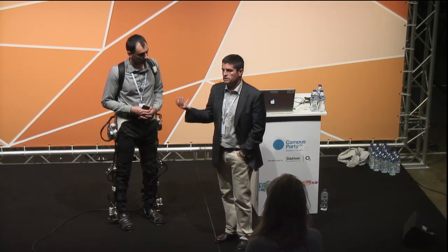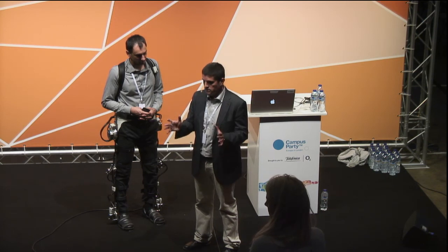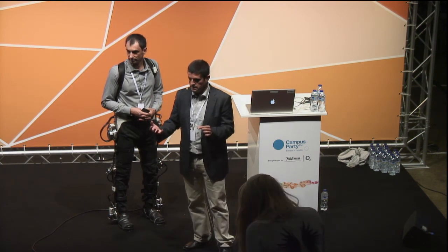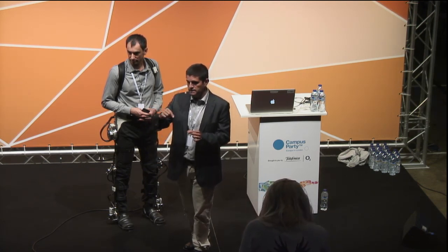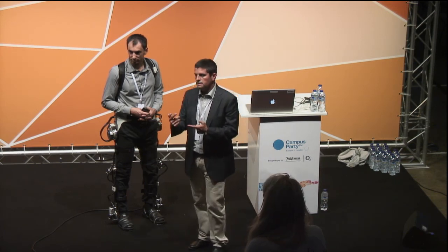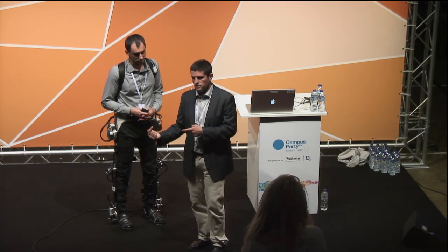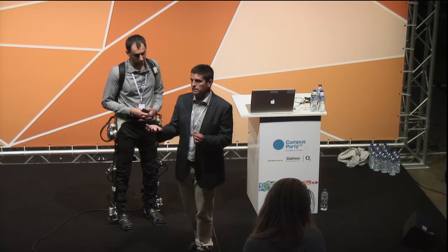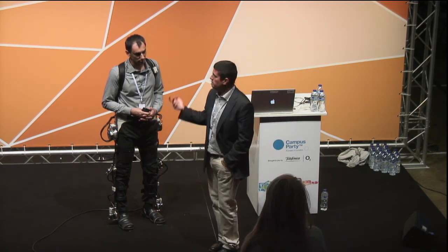Then we have several ways of controlling the system. One of the ways is what we call assist-as-needed. In this particular strategy, what we have is an ideal gait pattern. So we monitor the activity of the patient, and we assist each of the joints of the patient up to reaching this ideal pattern that is taken from a healthy person. As long as the user gets rehabilitated, he will gain force, range of motion, and so forth. So the strategy will adapt also to these conditions and will apply less force because less force is needed to keep walking. And this is done automatically by the control software.